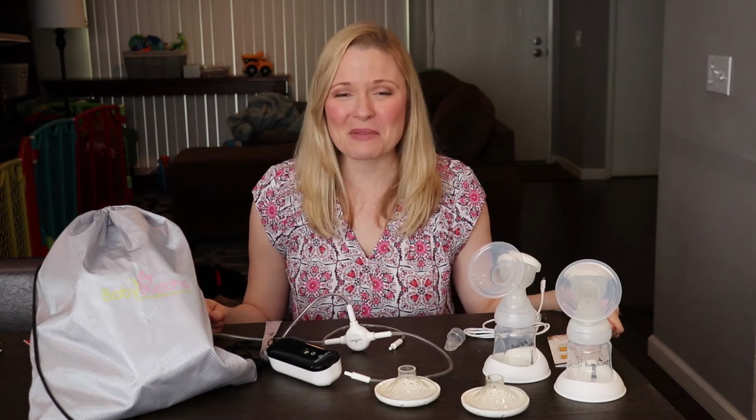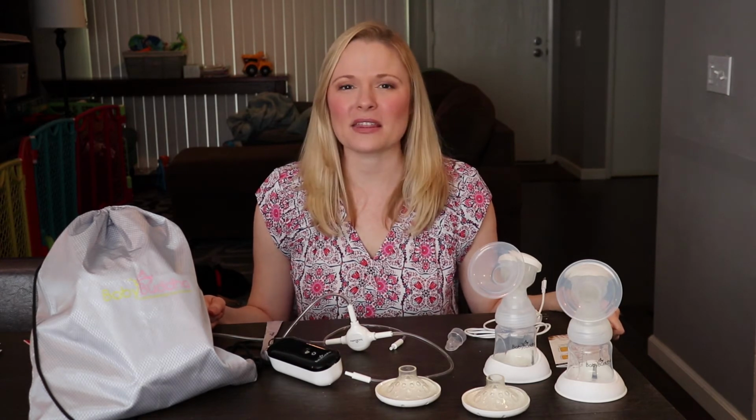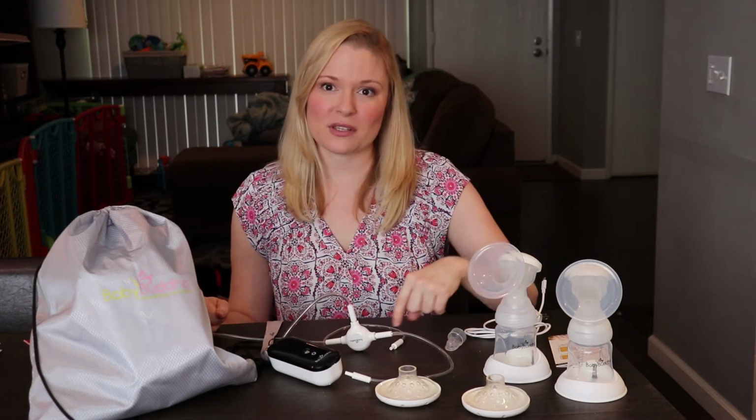I don't know. Maybe they'll change that a little bit more in the future, but that's definitely something that you would want to consider. And you'd want to measure yourself before you purchased your Baby Buddha.